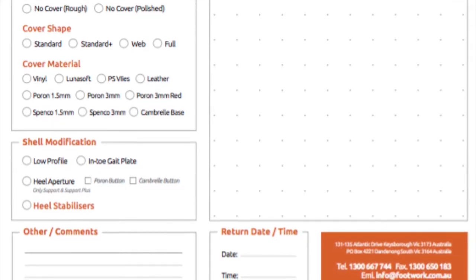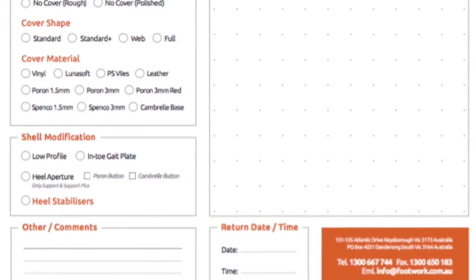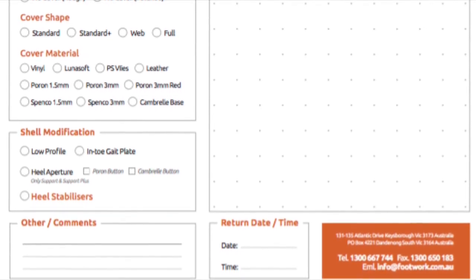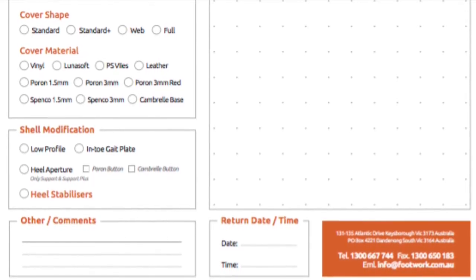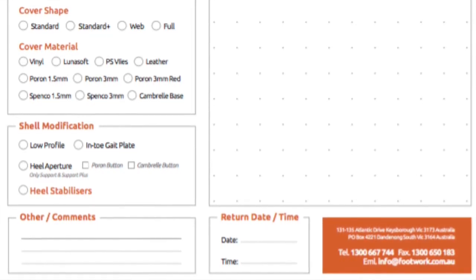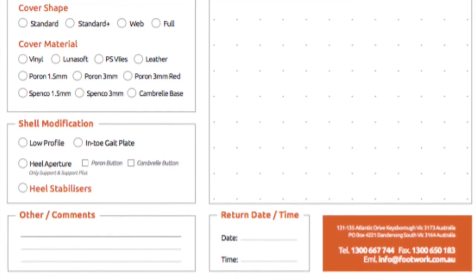If you have any additional requests, these can be written in the comment section of the form. If you need more information about specific features of the Joeys, for example, more detail about the different arch fill techniques or how rear foot correction is applied, then please refer to our YouTube channel for short videos which explain the main orthotic manufacturing techniques.